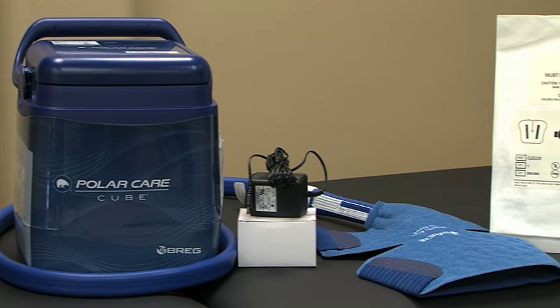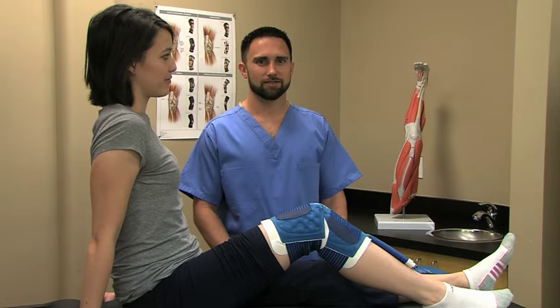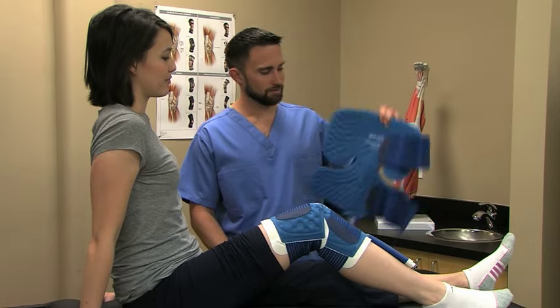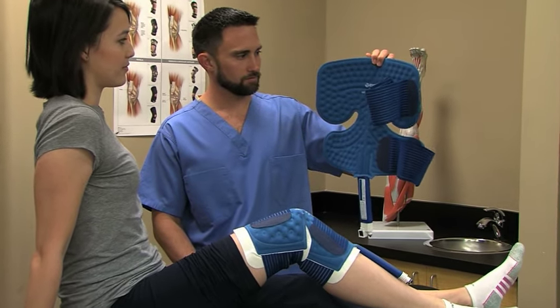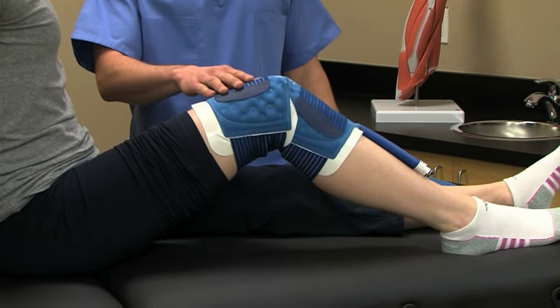The PolarCare Cube consists of four parts: the unit, the power supply, the pad, and the insulation barrier. PolarCare units come with body part-specific pads. This one is a multi-use pad, which can be used on various core body parts, while this one is for the knee.